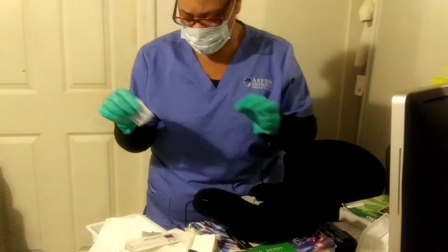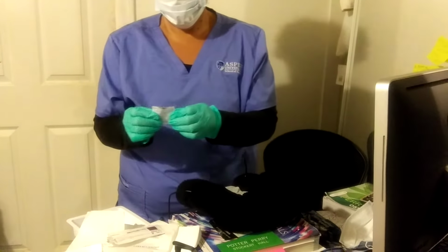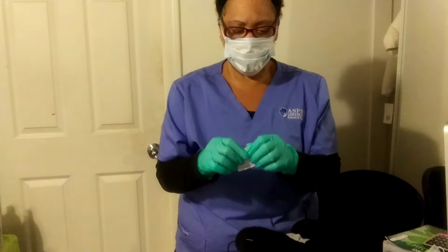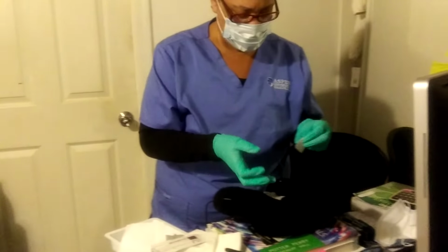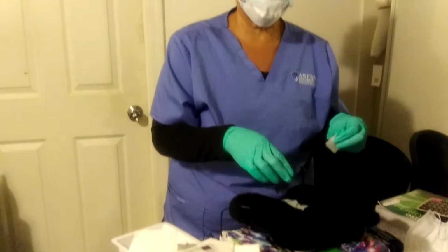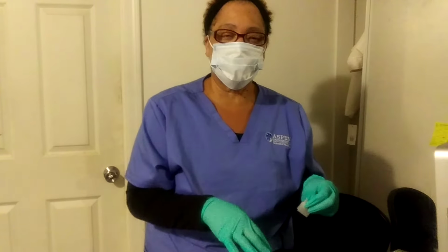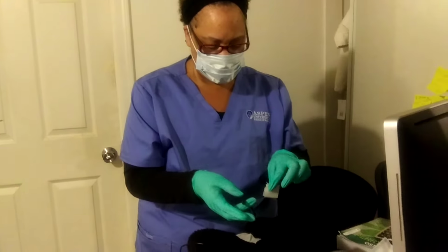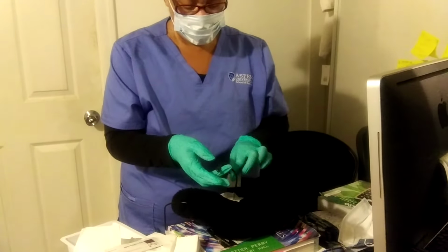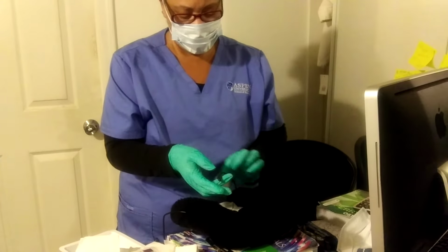Then I take my shear. It's like a sticky foam. We call it shear prep, or you can call it skin prep. I can take this, just so the skin, I clean the site for 30 seconds. As I'm cleaning the site also, I do my inspection, make sure it's not red or swollen, and there's no oozing coming from the site. And I take my shear prep, and I rub it on the skin. This helps the dressing to stick more firmly. I let that dry.